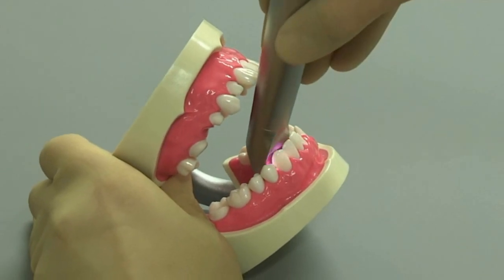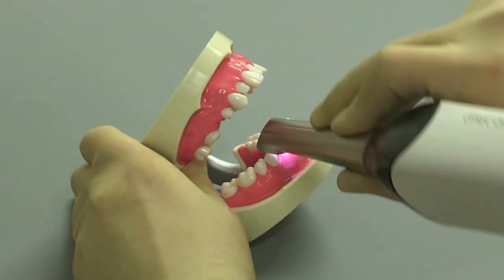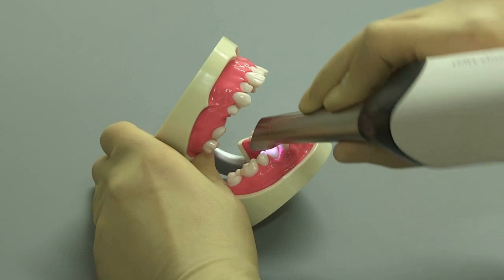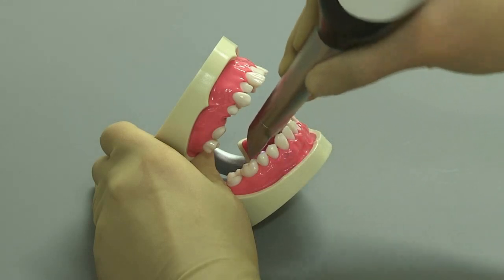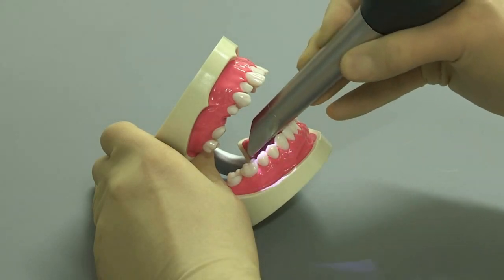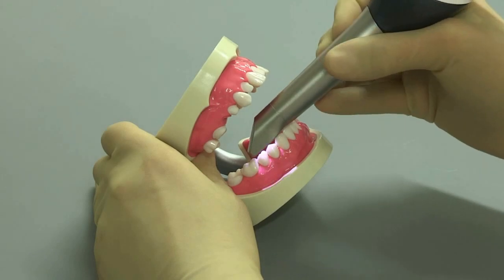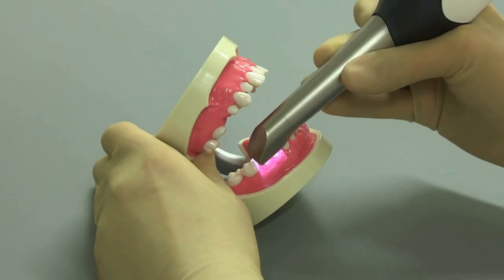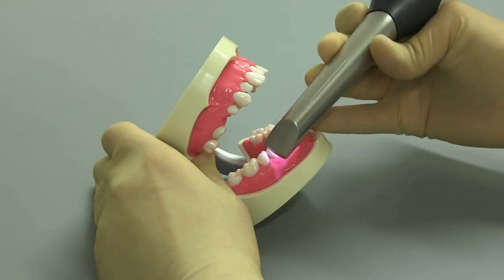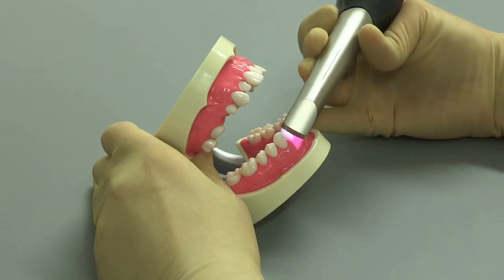Emphasize the lingual scanning movement in order to fully acquire the lingual area of the front teeth. Once you have reached the premolar area, turn the camera with its tip to the distal direction of the molar region.